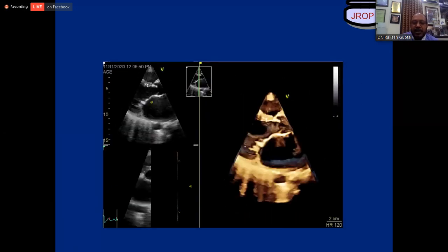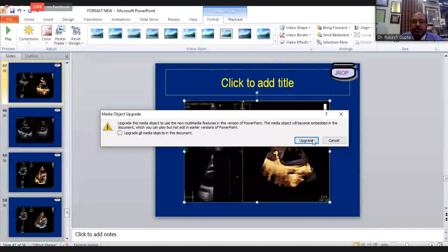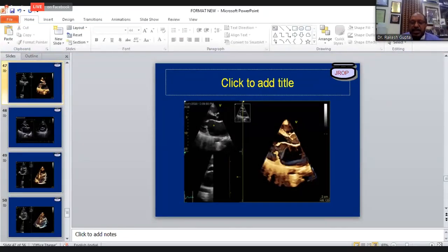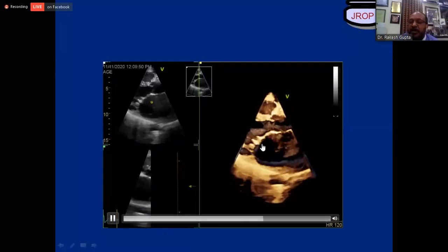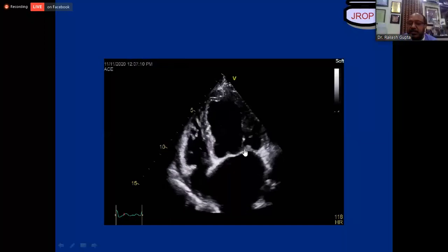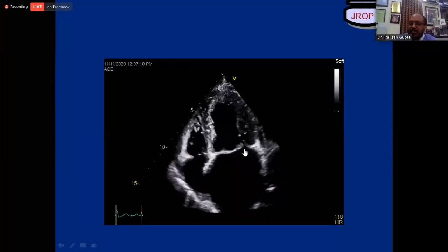If you happen to look at this mitral regurgitation, especially in the 3 dimensions view, look carefully at what exactly is happening in this 3 dimensions view. There's a flail AML which is seen over here. And once I showed you a 2 dimensions window for function, not only this, sometimes there's non-coaptation of the mitral valve leaflets.